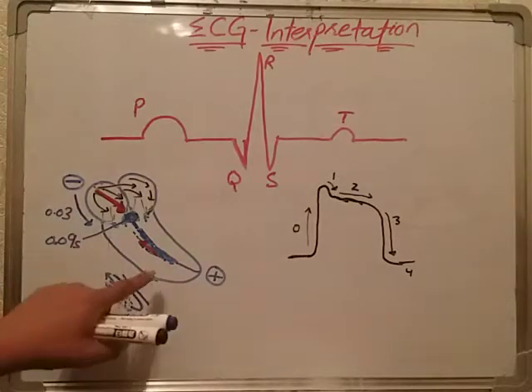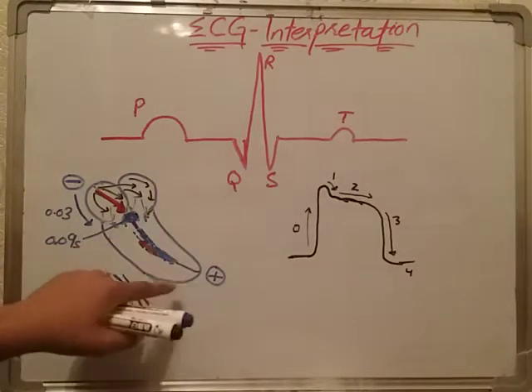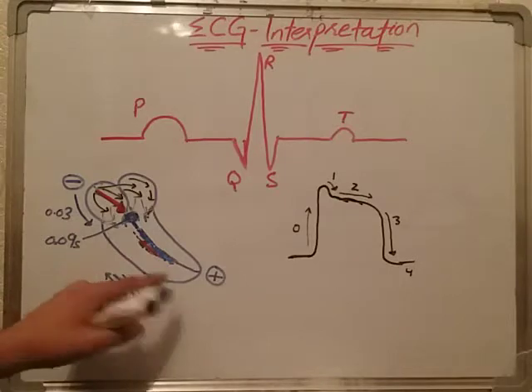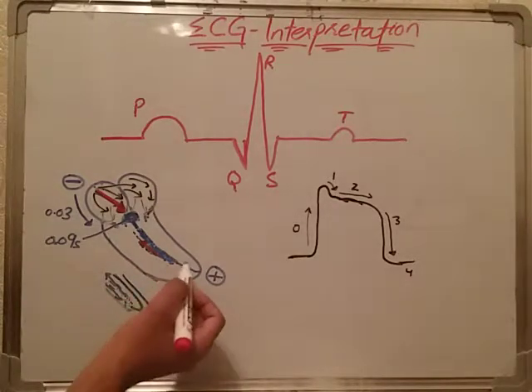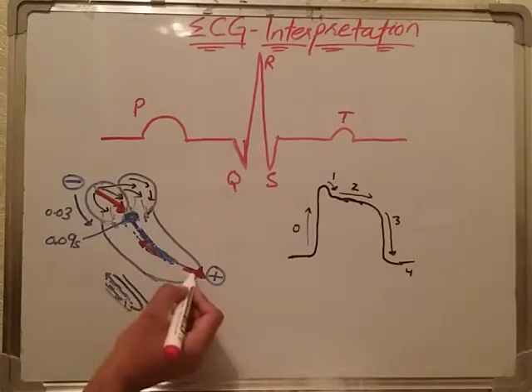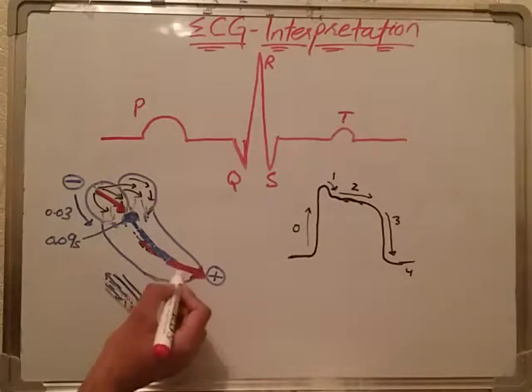And after this, the impulses move toward the Purkinje system, and this Purkinje system depolarizes the ventricular muscles. It starts depolarizing the ventricular muscles, and we can make a graph like this, a point of depolarization toward the positive. But this depolarization is very strong.